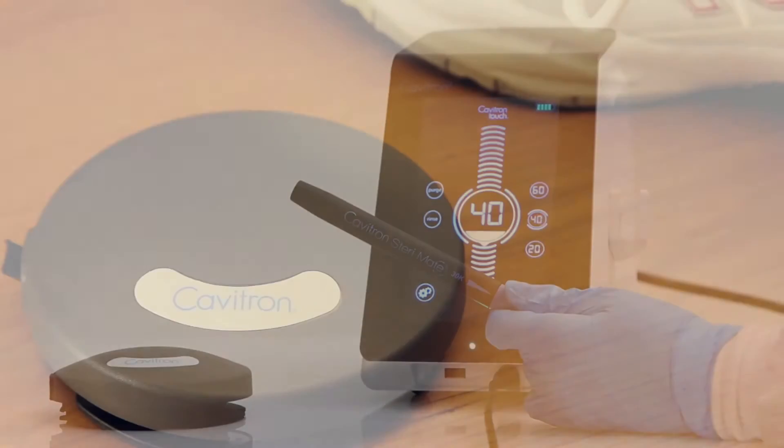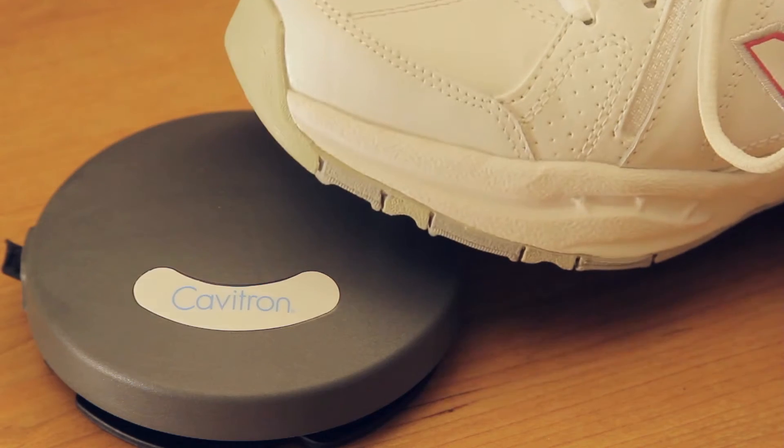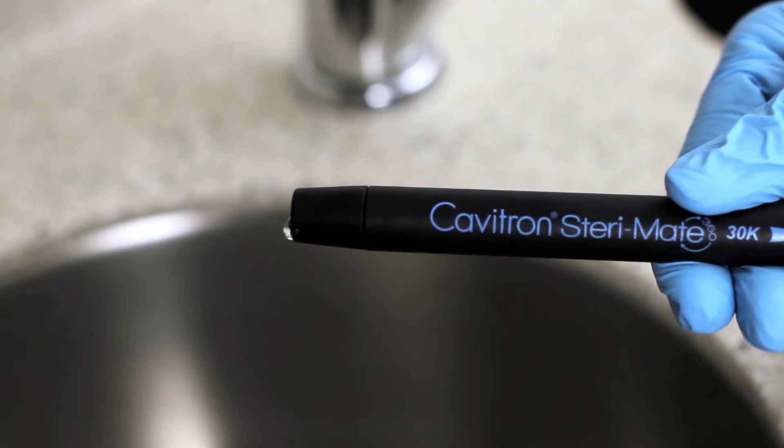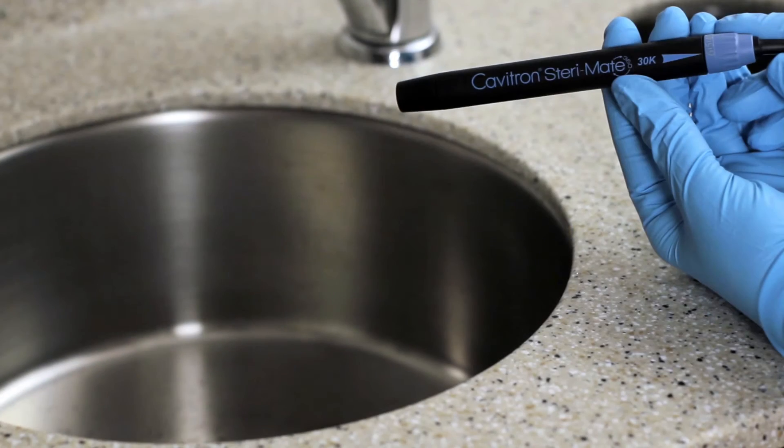Once the cord and handpiece are connected, press the tap-on foot pedal until water exits to release any air bubbles that might be trapped inside the handpiece.